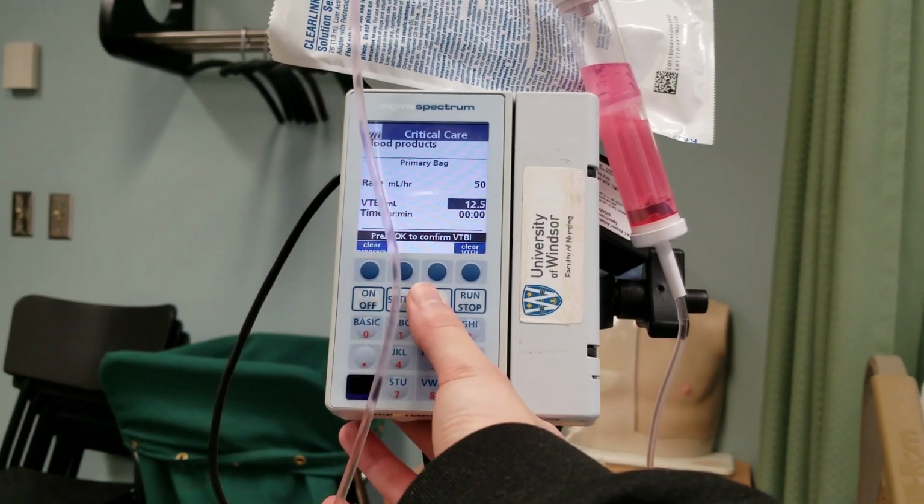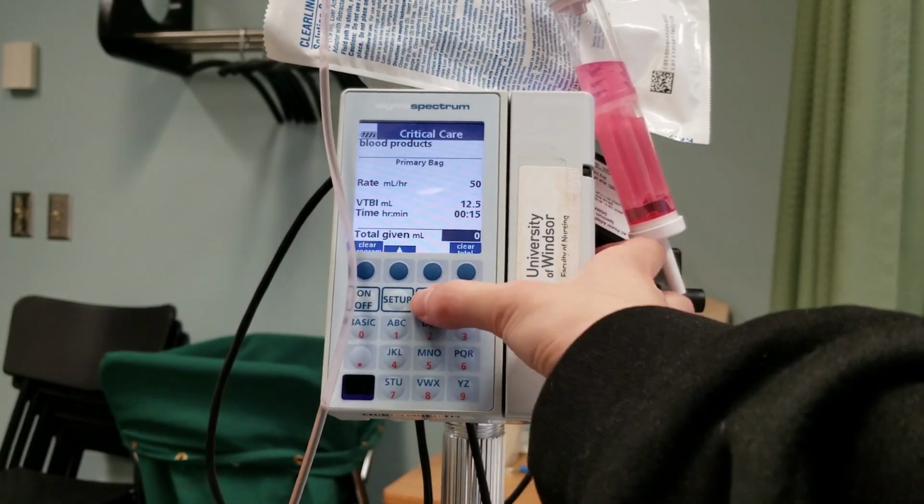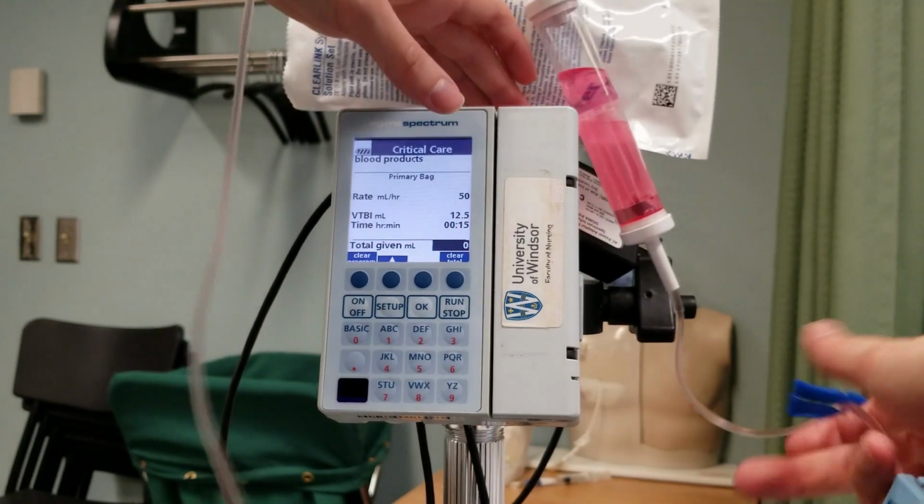And then you'll see that when I click OK, it's going to automate our time to be 15 minutes. So we know we've done that correct. So I'm going to click OK. And then I'm going to load my set in the pump.